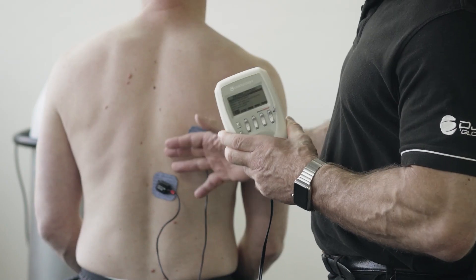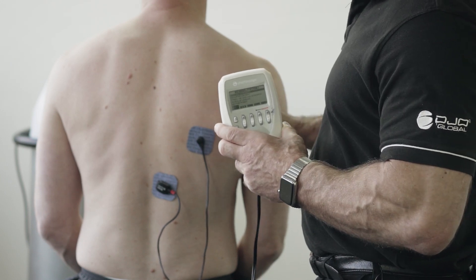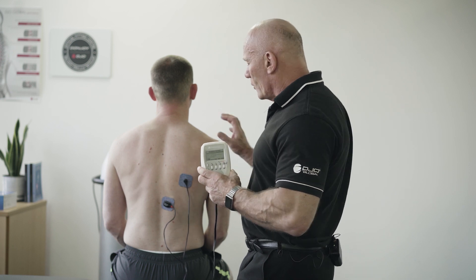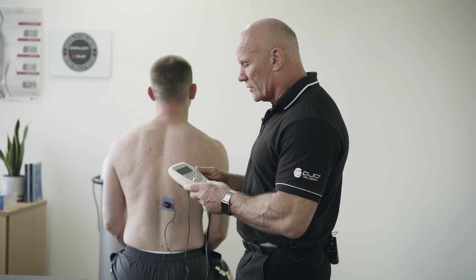I've got a patient here with poor scapular stability and I want to encourage him to use his lower traps before we do mobilization of the shoulder.